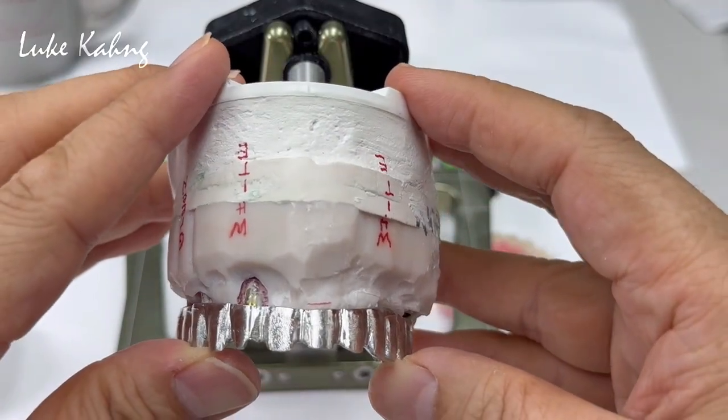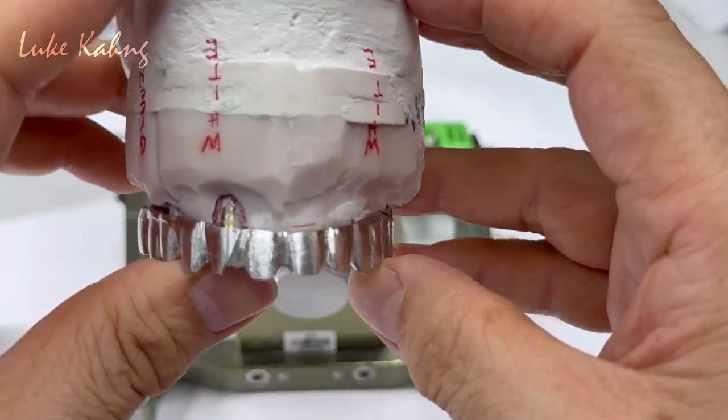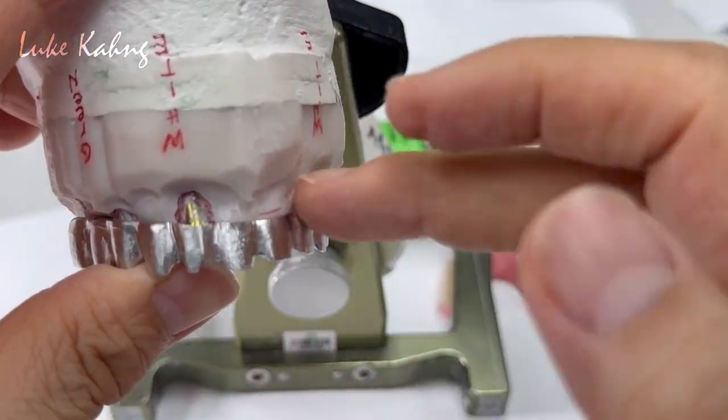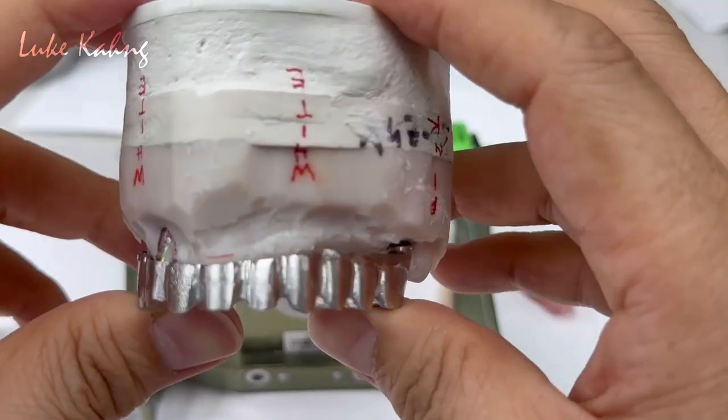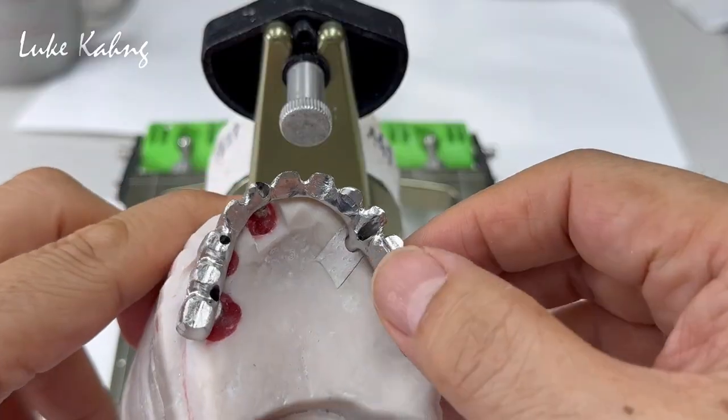So we're going to put down the scan and the design so we can see this. This is our behind-the-scenes story — it's a very tough case. It's really thin bone implants, which is a good idea.